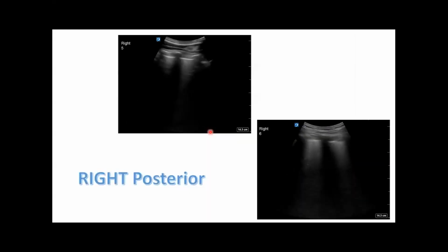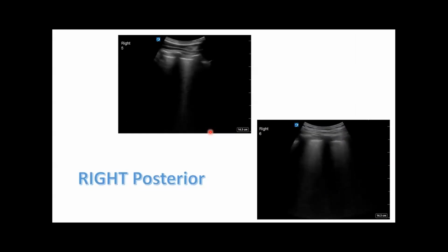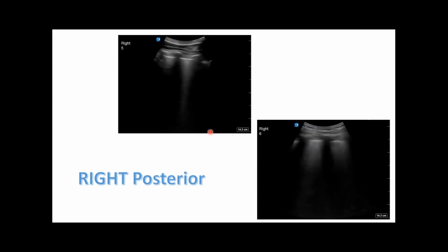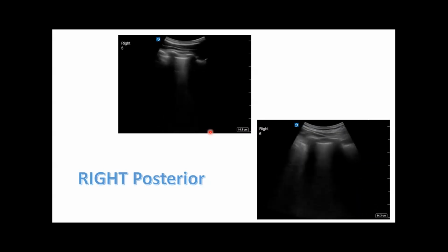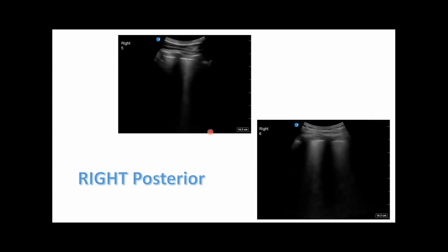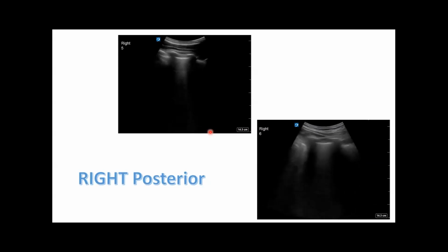So quick question, Dr. Clark. Yeah. Sorry. So you said that since it's in patients with COVID, these fused B lines are one of the signs. So in patients with COPD who are chronic COPDs, don't we get these lines in them as well? So how do we differentiate? Is it COVID specific or not? I didn't get that part. You said that it was COVID.